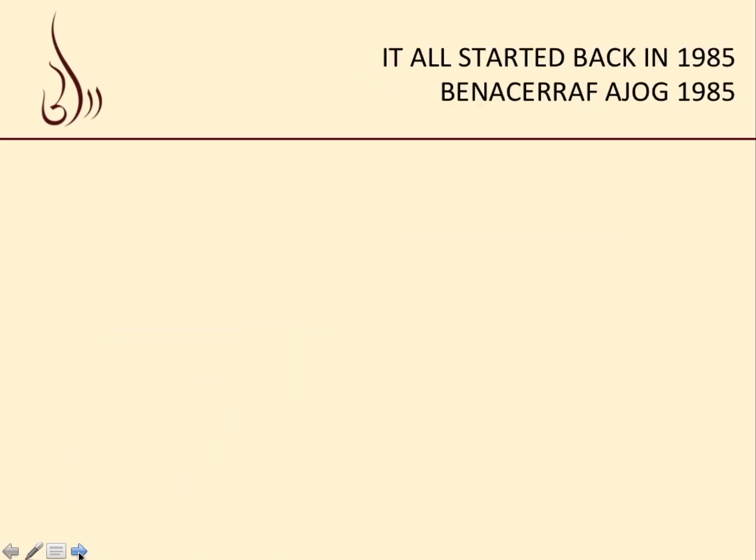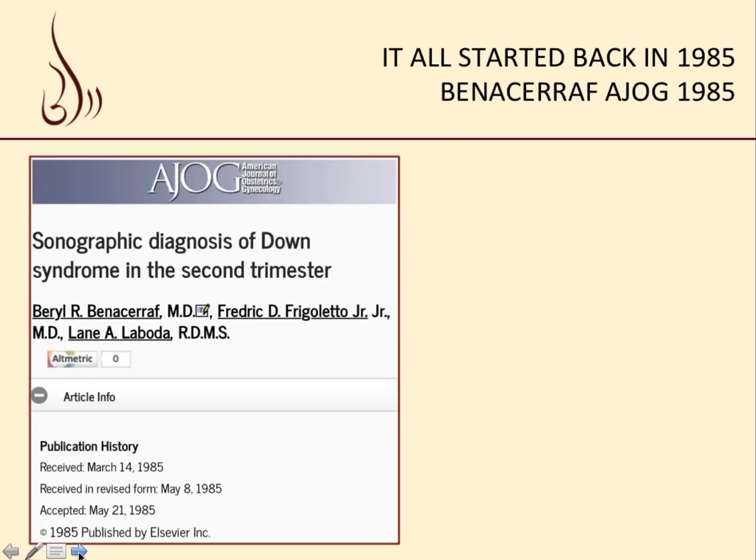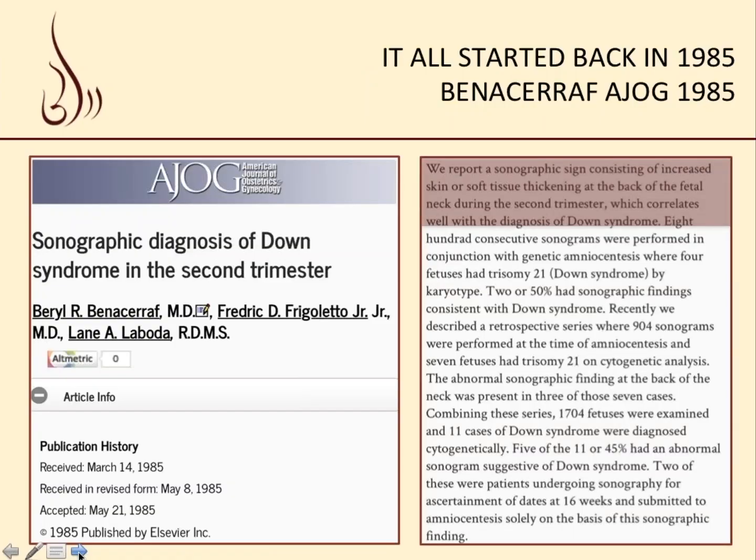And it was Professor Benacerraf in 1985 who first described the nuchal fold, where it was reported that there's a sonographic sign consisting of increased skin or soft tissue thickening at the back of the fetal neck during the second trimester, which correlates with the diagnosis of Down syndrome.